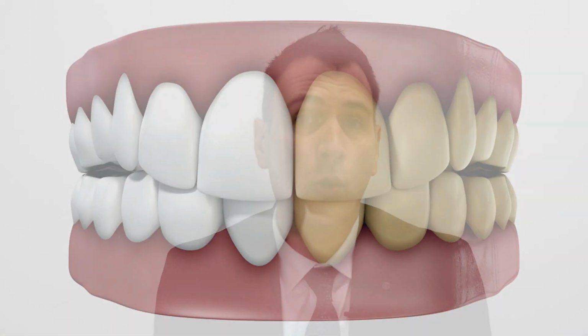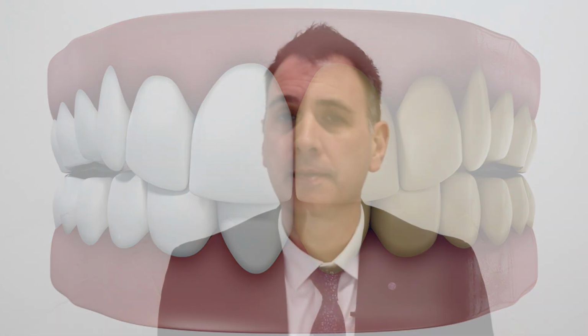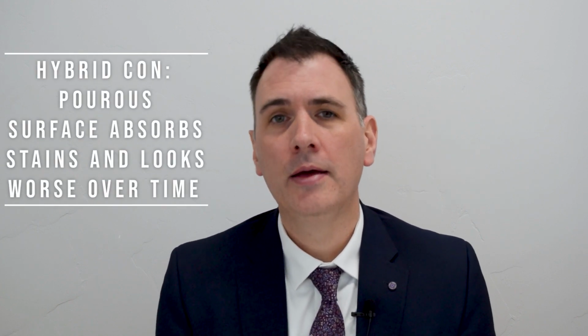Acrylic also has some drawbacks to it. It tends to be pretty porous. And because of those pores, it doesn't stay clean very easily. It soaks up food, it soaks up saliva, soaks up odors, and soaks up stains. And so you'll notice that that appliance tends to not look as good as time goes on because of the porous nature of that material. So a lot of our patients will go to the next option, which is the zirconia option.